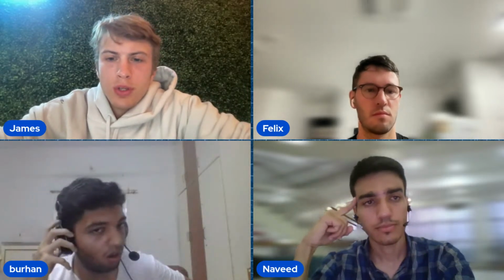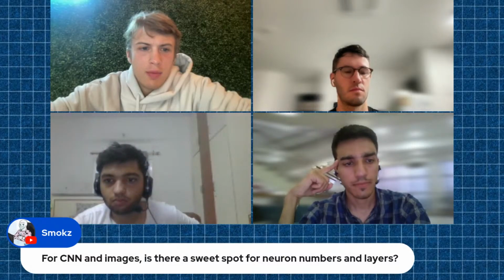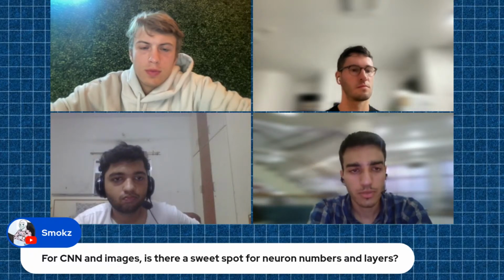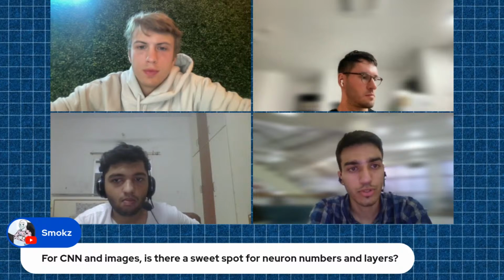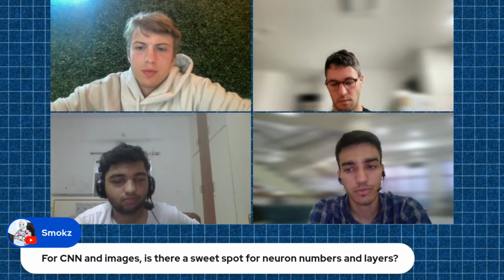We had a couple more questions from the chat. One said, for CNN and images, is there a sweet spot for neuron numbers and layers? The sweet spot comes from experimentation. There's no one size fits all solution, so you'll have to experiment with different numbers for every single problem.